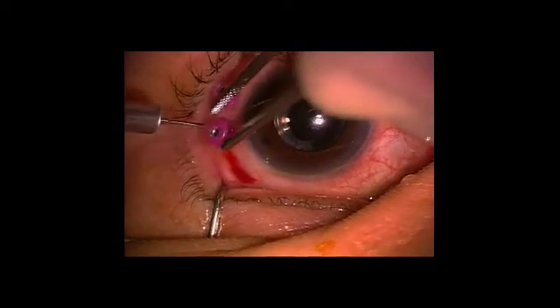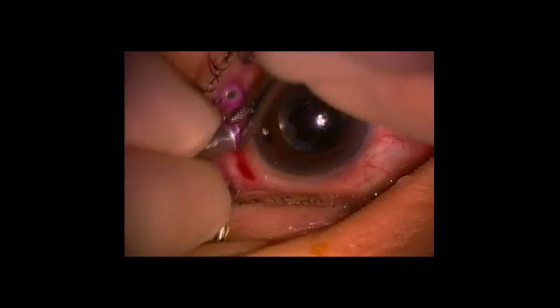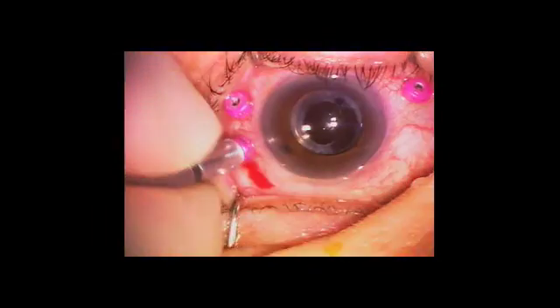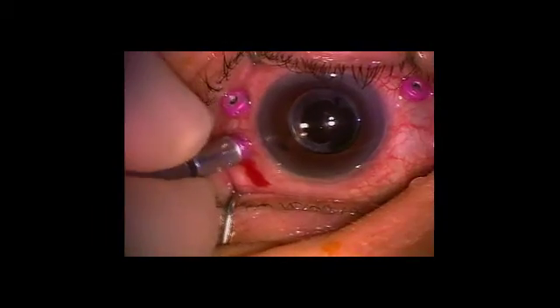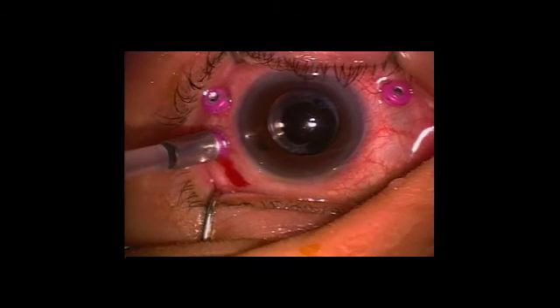What I'm doing here is inserting the infusion cannula, which pumps in saline. And then when the light went off, I wanted to check that the tip of the infusion cannula was safely within the eye. And now you can see the dense vitreous opacification, or the floaters, within the vitreous.